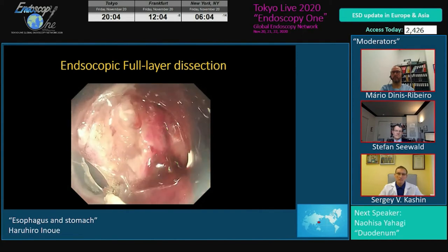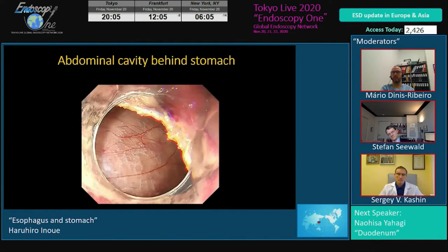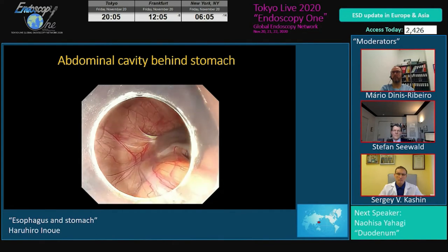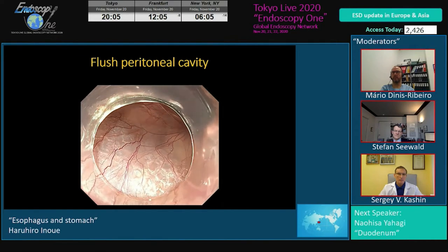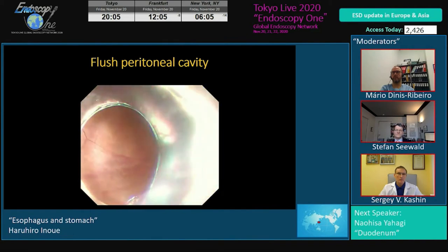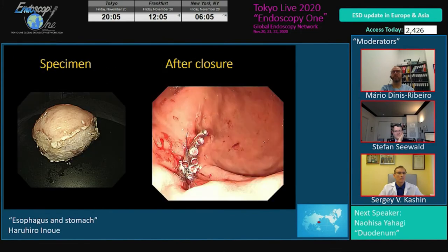Now we are dissecting the distal end. After dissection, we are going into the peritoneal cavity. We can see the spleen. And then I think it's better to wash the fluid away. During the procedure, we don't touch the tumor itself, but I think it's better to wash the peritoneum out. After this, we close the mucosal entry using clips. The left side is the specimen.